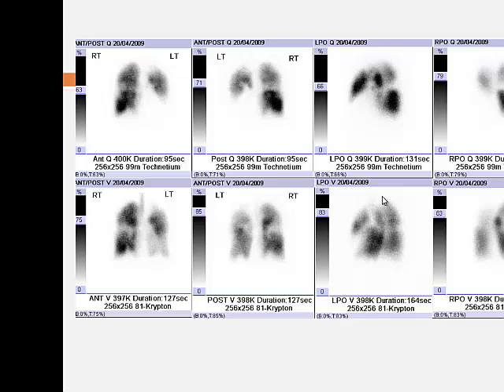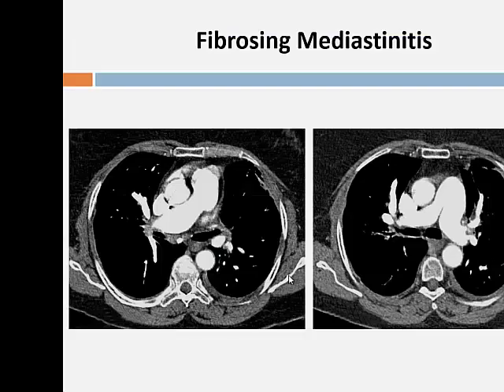It's mostly matched. So you'd probably be erring on the side of saying this is an intermediate probability, because there's probably at least one area that isn't matched. So on the PIOPED criteria, you'd then have to say, hang on, this is intermediate probability. So not that much help, really, because it's not giving you a yes-no answer, which is what we want. So you might go on to do more scanning.